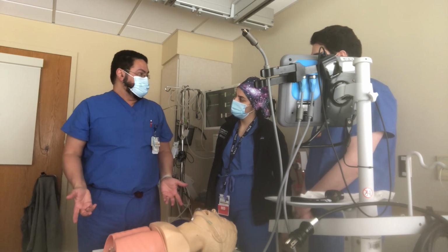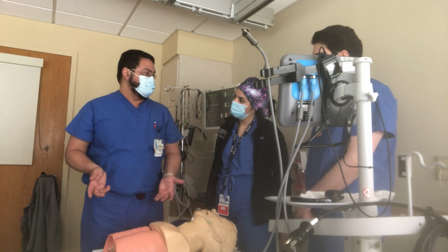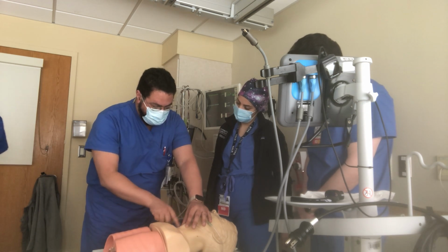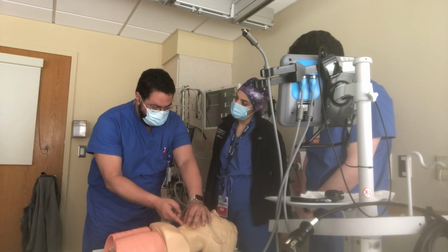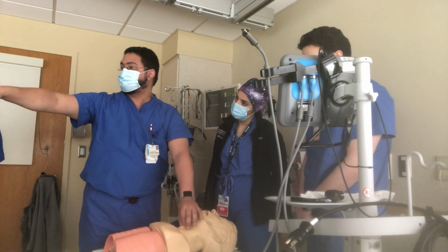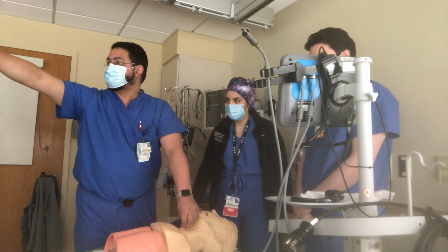What are you gonna do? You guys freak out, and half the nurses are gonna run away, right? So we're gonna cut like this, so then we can feel it, and then we can cut horizontal, and then put something called... Can I have the cric kit, please? It's on top, the top.